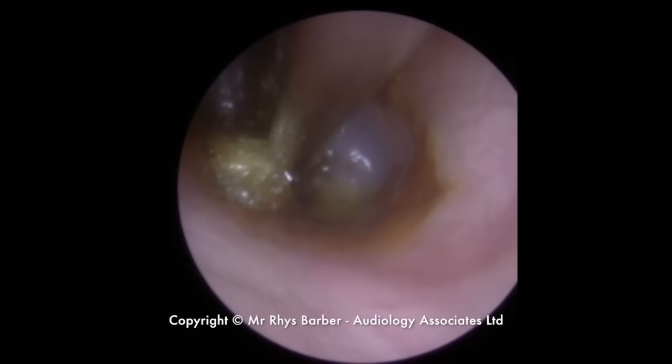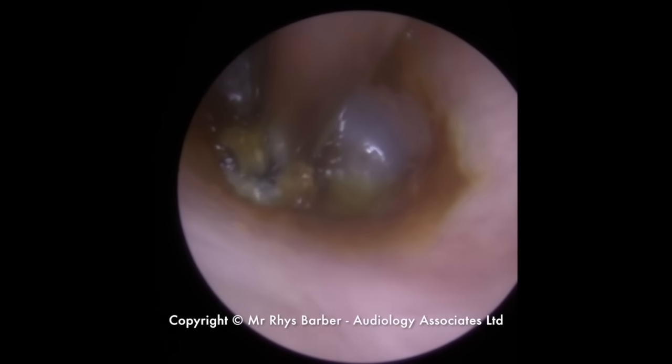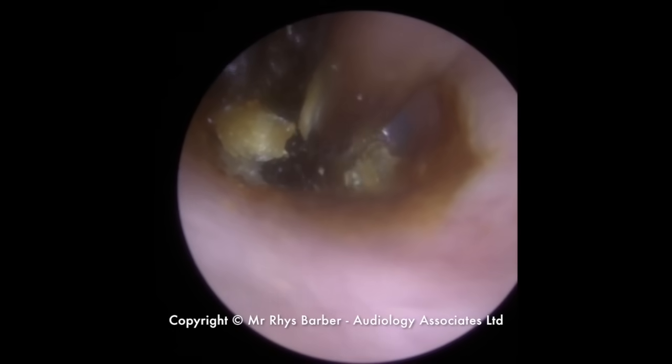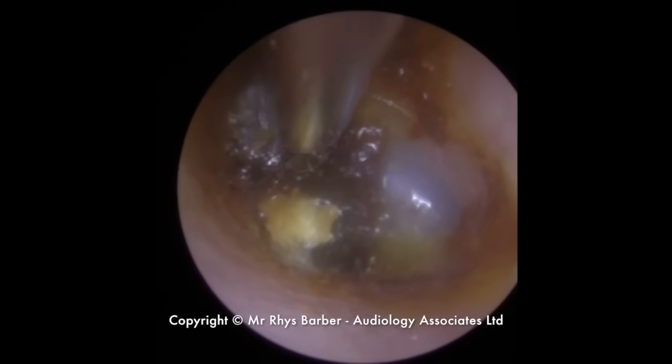You can see there's a little bit of wetness in there. That's where the olive oil's gone in just to try and soften some of this wax a little bit. So very gently, trying to manoeuvre some of these smaller pieces of earwax away, just working our way around.